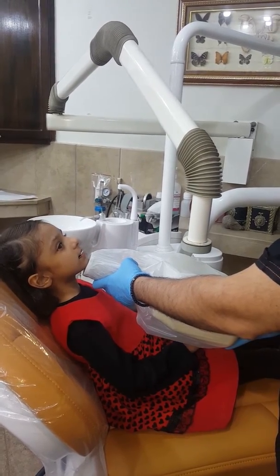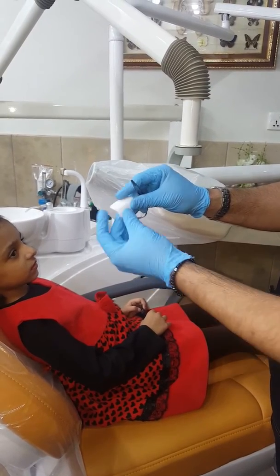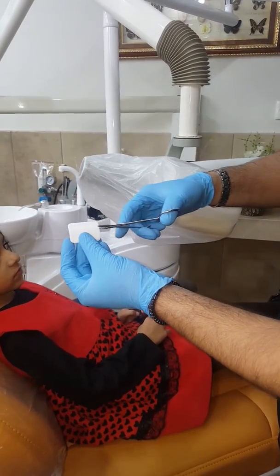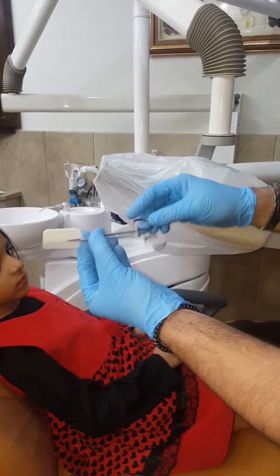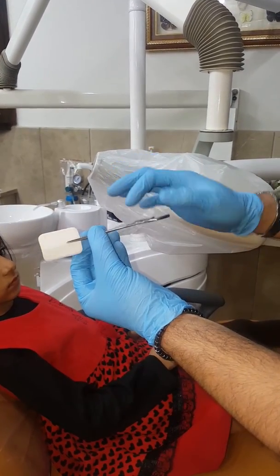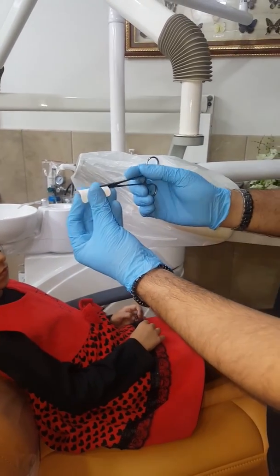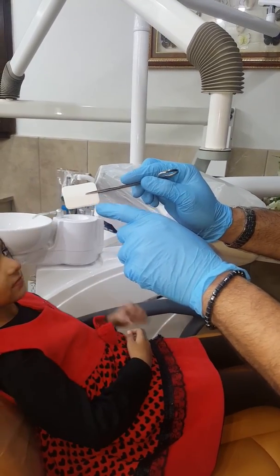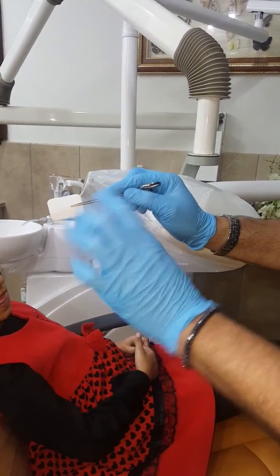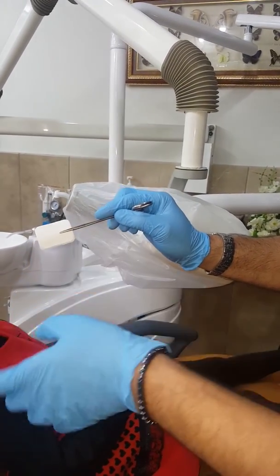For the survey of the posterior region, we're going to take this as a bitwing radiograph. For bitwings, you want to hold the film right down the middle and snap it with the hemostat, but don't snap it too much—you don't want to pinch and perforate the film cover. I would keep the pimple, the dimple on the film, all the way to the bottom on both sides. That way we know exactly which way the orientation is: the pimple is anterior on the right side and posterior on the left side.